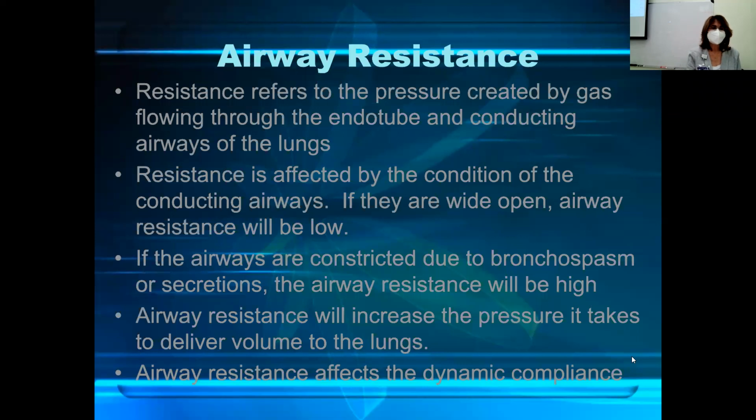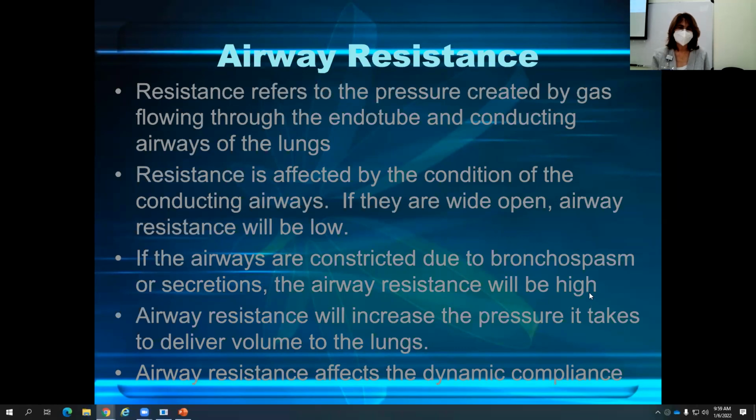Resistance is affected by the condition of the conducting airways. If they are wide open, airway resistance will be low. If the airways are constricted due to bronchospasm or secretions, airway resistance will be high. Airway resistance will increase the pressure it takes to deliver volume to the lungs.